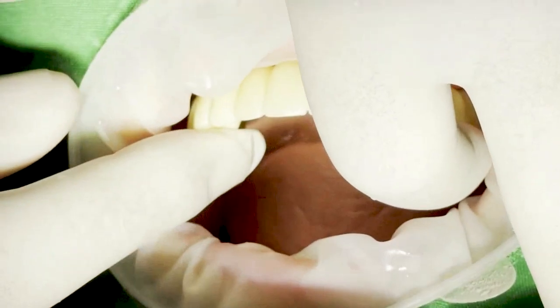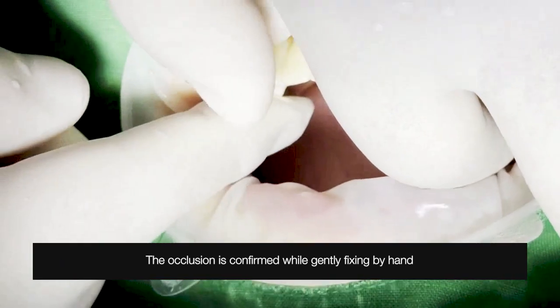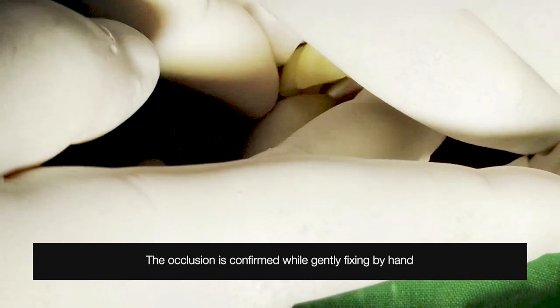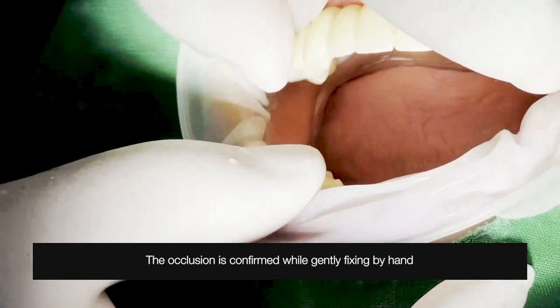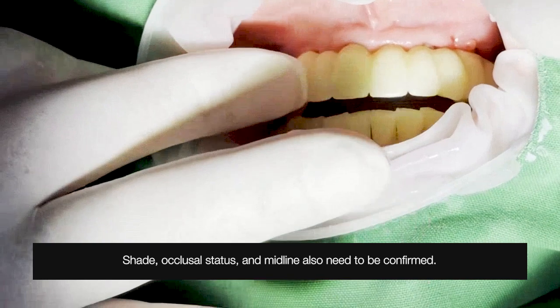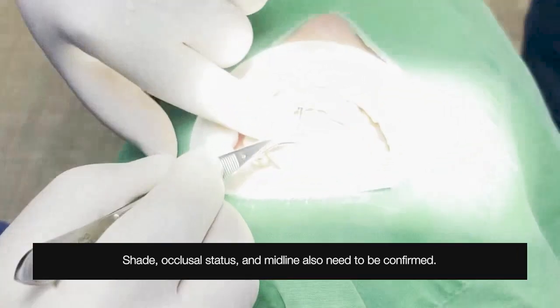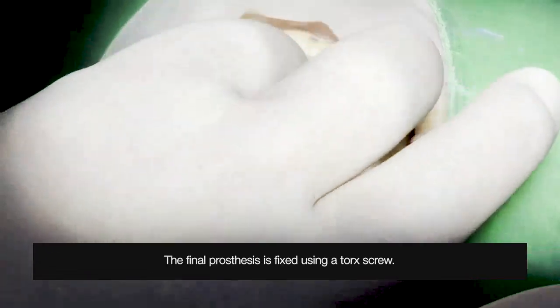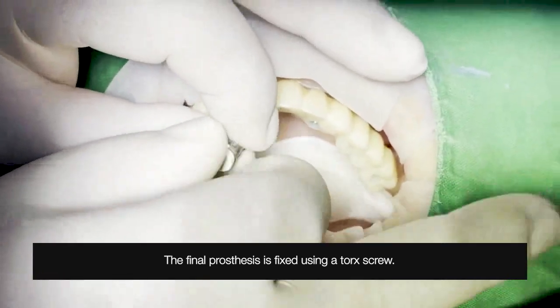Now let's take another look at the process through a real clinical case.